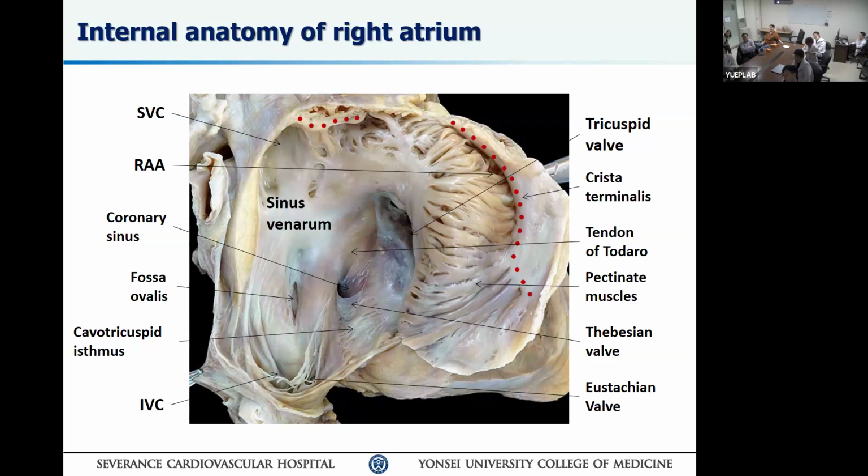For some patients, it is very pronounced, very deep. The SVC coming down, suddenly it jumps in. So you think that's also bad. Be careful. Make sure you don't get in that trap. If you poke there, you will have what you see in the picture. So this is one of the areas that you really want to pay attention to.